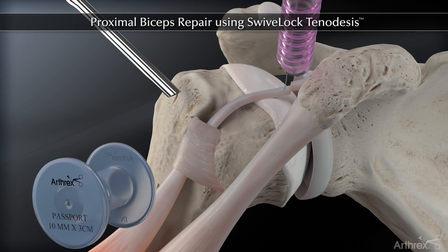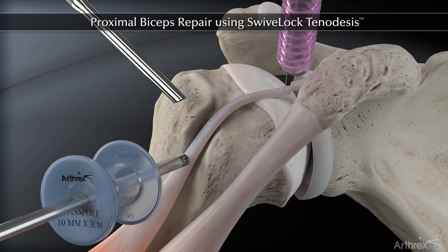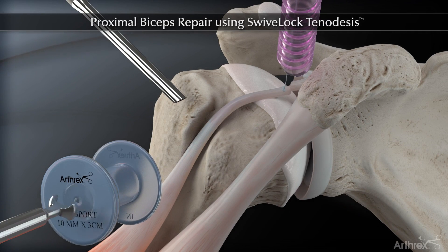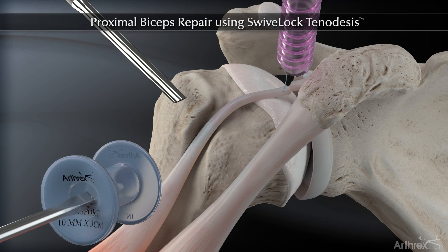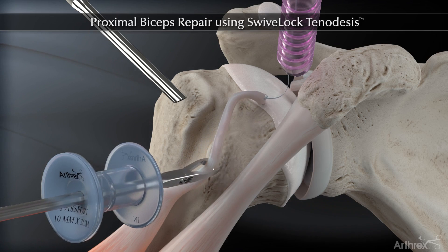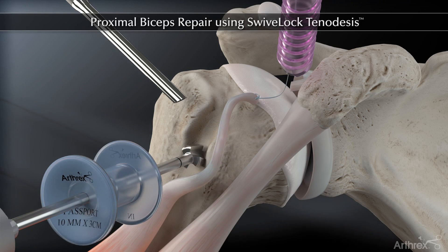Move to the subacromial space and insert a 10mm passport cannula inline with the intended anchor insertion site. A sizer may be used to help select the desired implant. Create a bone socket in one step using a piloted headed reamer.